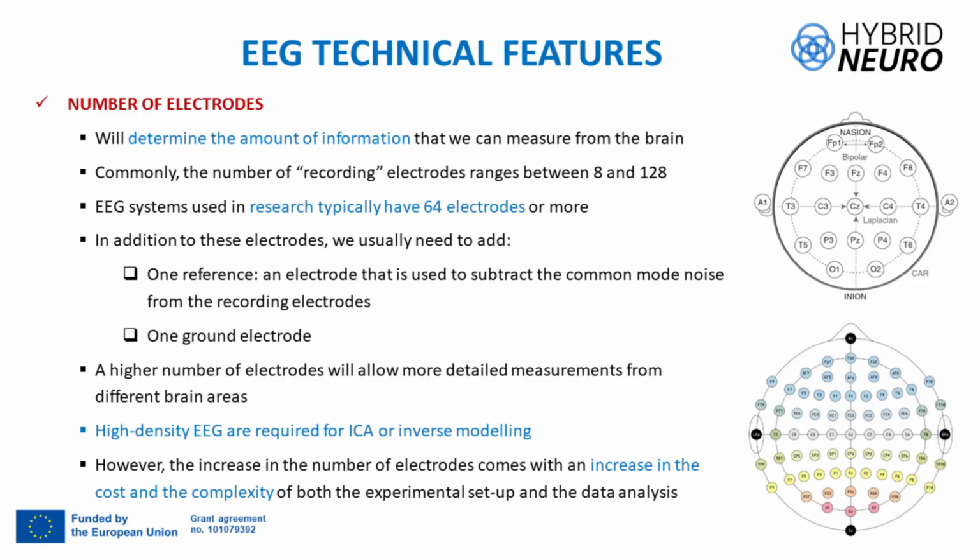Also, when you have many electrodes, the effect that we commented before is more important. For example, this is the volume conductive effect.